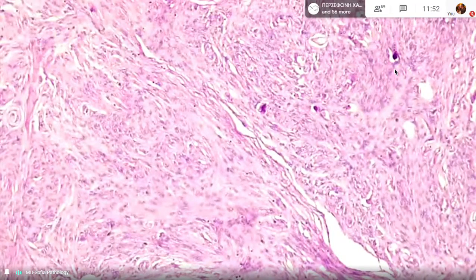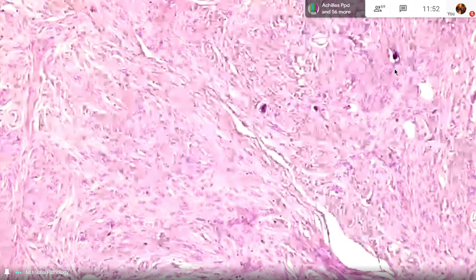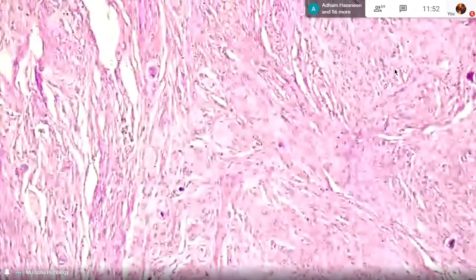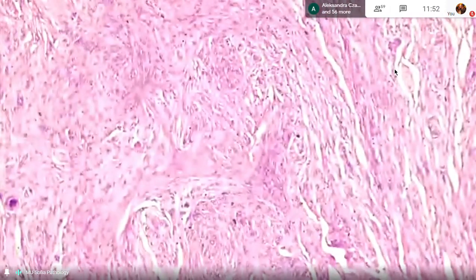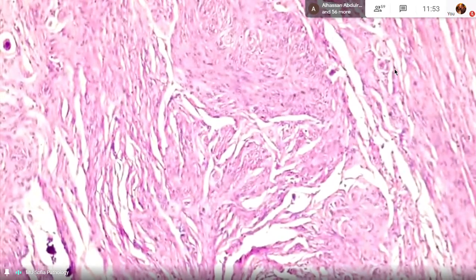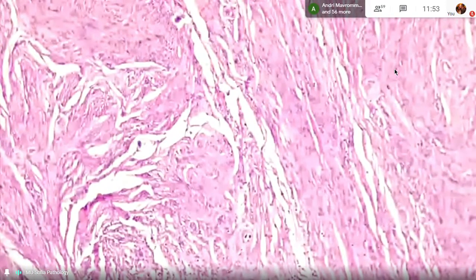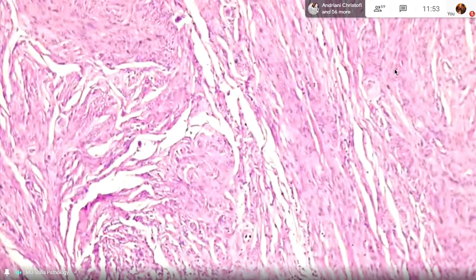Well, it looks like you have cross-sectioned an onion. Do you have this impression? The medical term for the description is not onion, but whorls, okay? But just to have an idea of what I'm trying to show you. Another whorl center here, okay? They're more globe-like, but the cells are orientated in this specific manner.